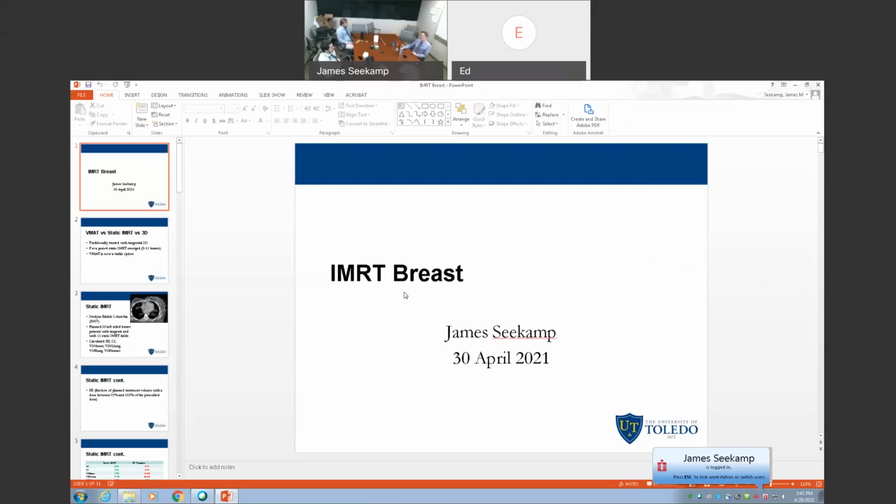There's only one 90% isodose line. But if you've got the robustness plans, there's multiple. So you could maybe take the one where you shift it by the worst case scenario, 1 centimeter, 1 centimeter, and then calculate it. But you come up with a contour, and you turn that contour, you come up with dose in the area around it, and you turn that into a contour, and that gives you a visible line downstairs on the machine that shows that if the breast is within that line, then we've got sufficient flash.